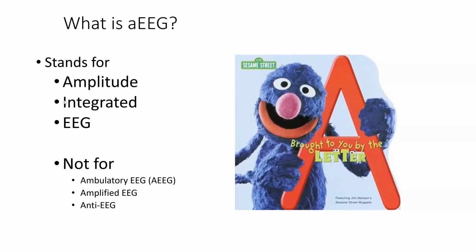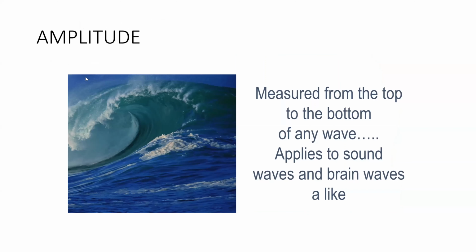It's not amplified EEG. It doesn't do anything to make it bigger and louder and easier to read. It does trend it, which we'll talk about a lot. And it's definitely not anti-EEG. We don't want to do aEEG and not do anything else. We still want to use our other tools that we have. So let's talk a little bit about these three words, amplitude integrated EEG.